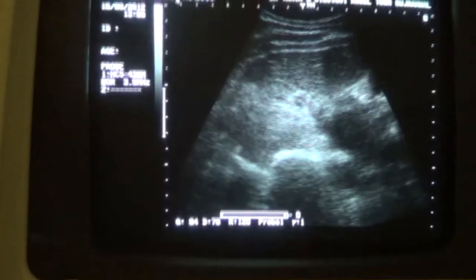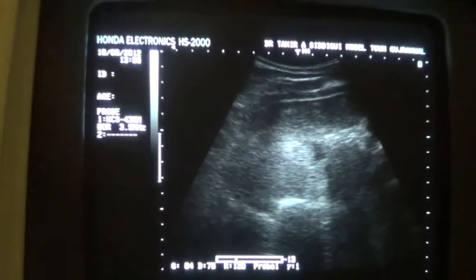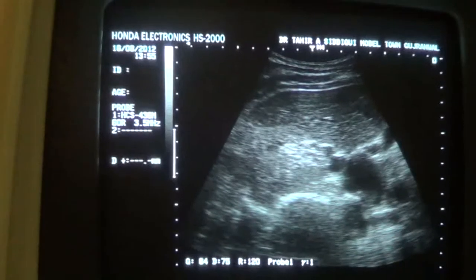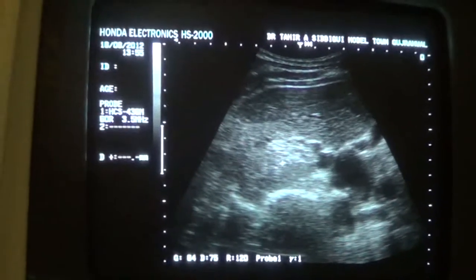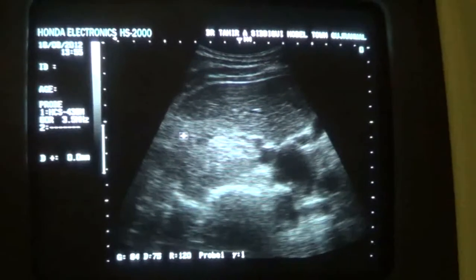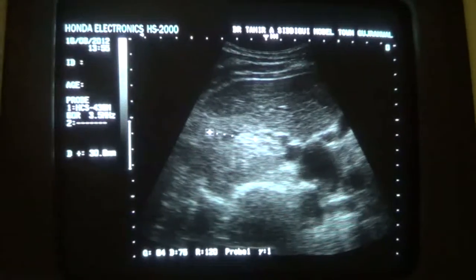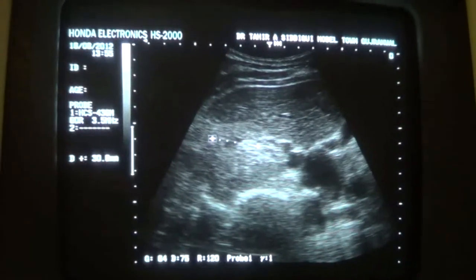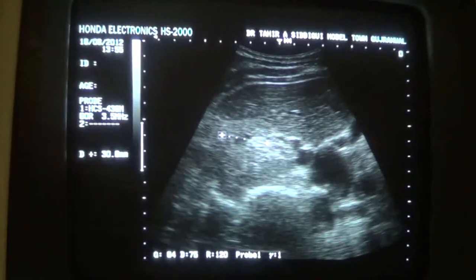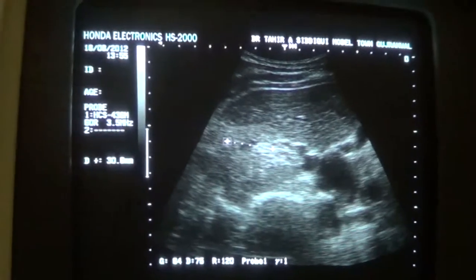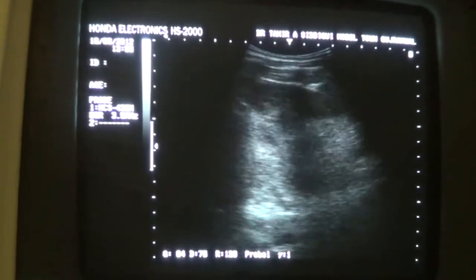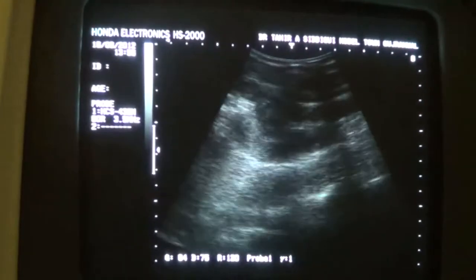This is the transverse section of the kidney, and you can see the vessels entering the hilum of the kidney. This is the left kidney — this is the normal. There is 3.0 cm; 2.5 to 5 cm is considered normal. Now I am moving towards the left kidney of the patient.